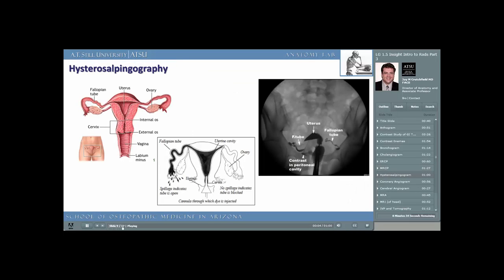A hysterosalpingogram is an invasive gynecological test to assess for causes of infertility. Once we understand the anatomy of the cervix, the endometrium of the uterus, and whether the fallopian tubes are patent (open), we can infer causes of a patient's infertility. The middle image shows a blocked fallopian tube on the patient's left salpinx. Whether it's blocked from cancer, prior surgery, or congenital malformation is unclear; it simply tells us the patient only has one properly functioning oviduct. A hysterosalpingogram, while still used today, has mostly been replaced by hysteroscopy — the use of a fiber optic endoscope inserted into the uterus and into each fallopian tube to assess for underlying abnormalities.